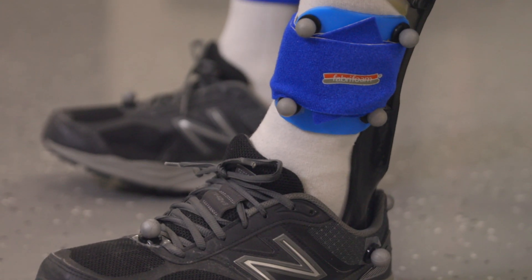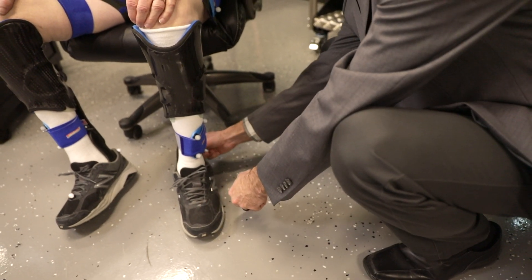We put a similar number of markers on the different segments: the foot, the lower leg, the thigh, pelvis, trunk, and then the arms. That data then goes into our biomechanical model.